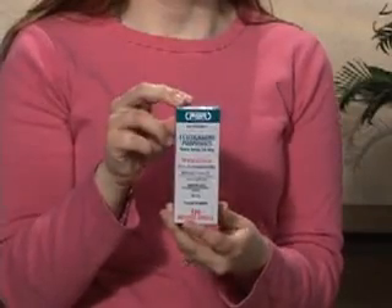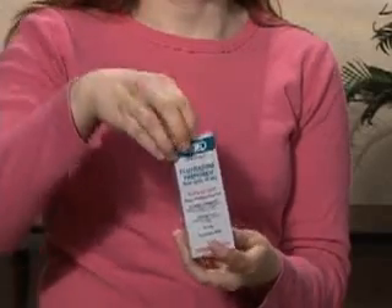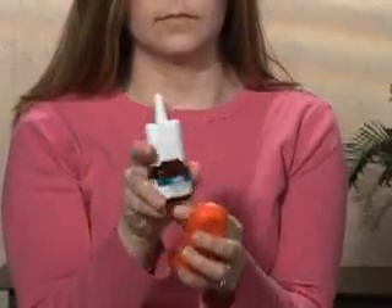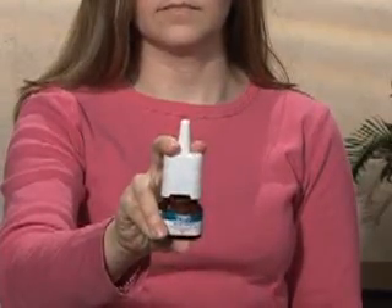Before you use an inhaler for the first time, the device needs to be primed. To do this, first remove the inhaler from the box and take off the cap that covers the nasal piece. Be sure to point the inhaler away from you and depress the canister to release a fine mist.